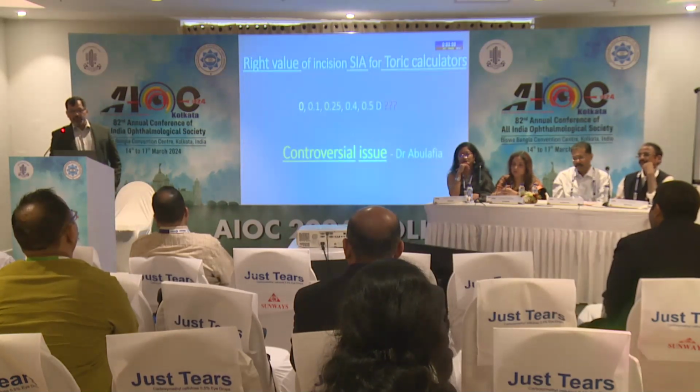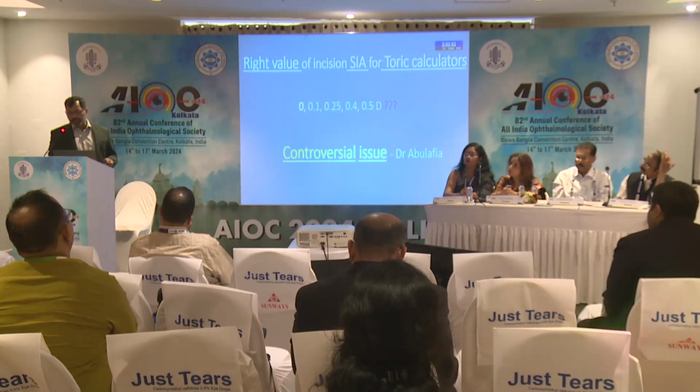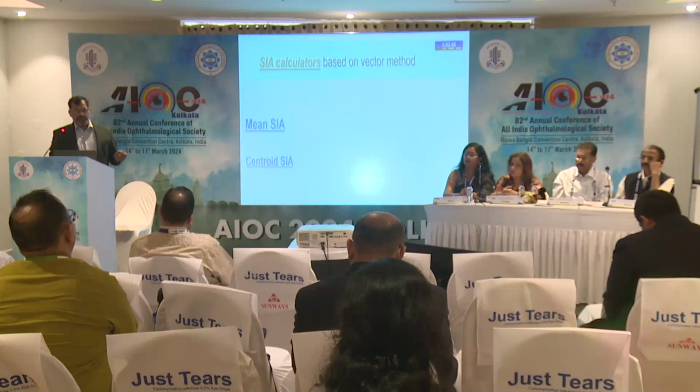So this is Dr. Abul Afia. He is saying, what value of the centroid SIA should I take in my toric calculator? Should I take it as 0 or should I take it as 0.5? So this is the problem. Let's see how we can solve it.